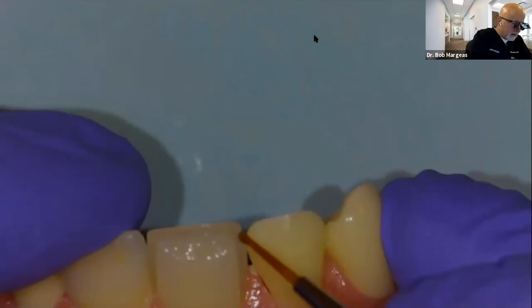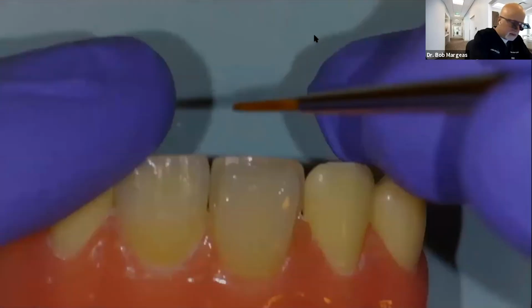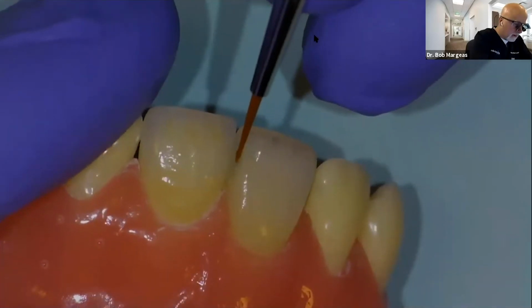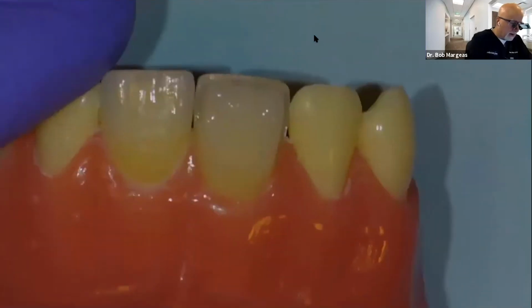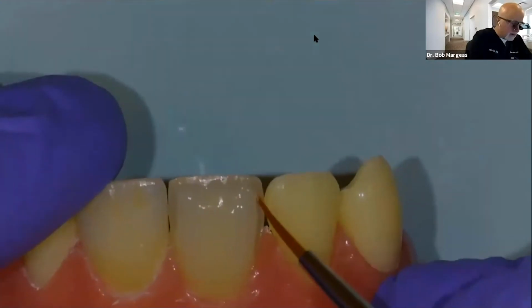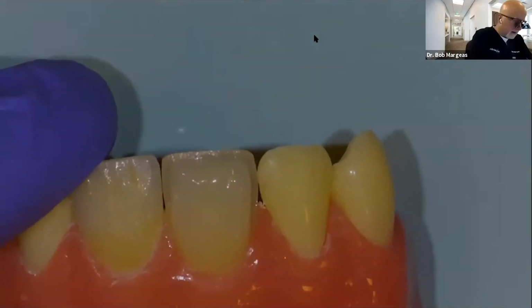I don't have a ton, but I'm going to just lightly put some here. I'm going to put some here. I don't need a lot because this is going to shine through, because I'm going to then use an achromatic enamel shade.